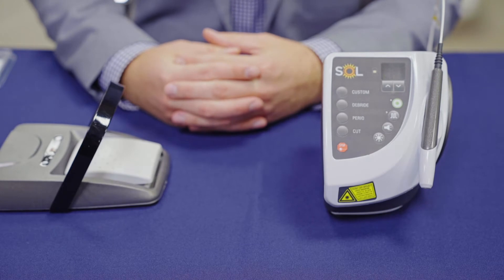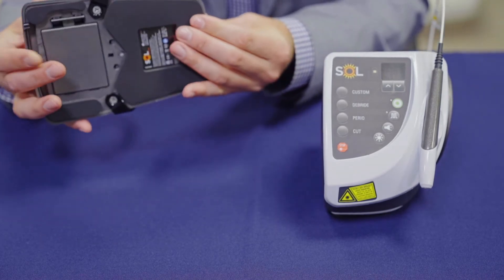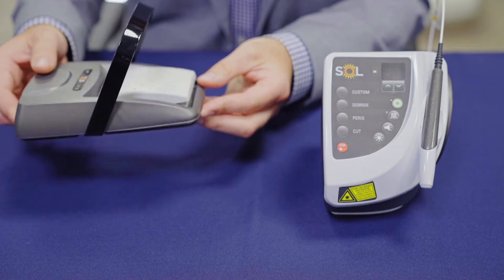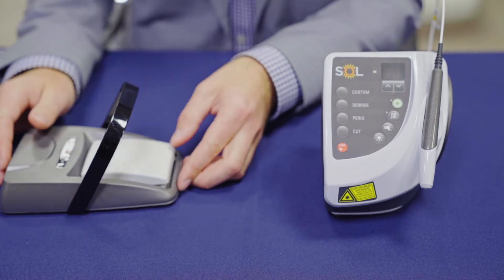Now that you're ready to start using your Sole desktop laser, the first thing you want to make sure is that you have inserted the batteries properly into the Sole foot pedal unit. This is a wireless foot pedal and it comes from the factory synced to your specific laser unit.